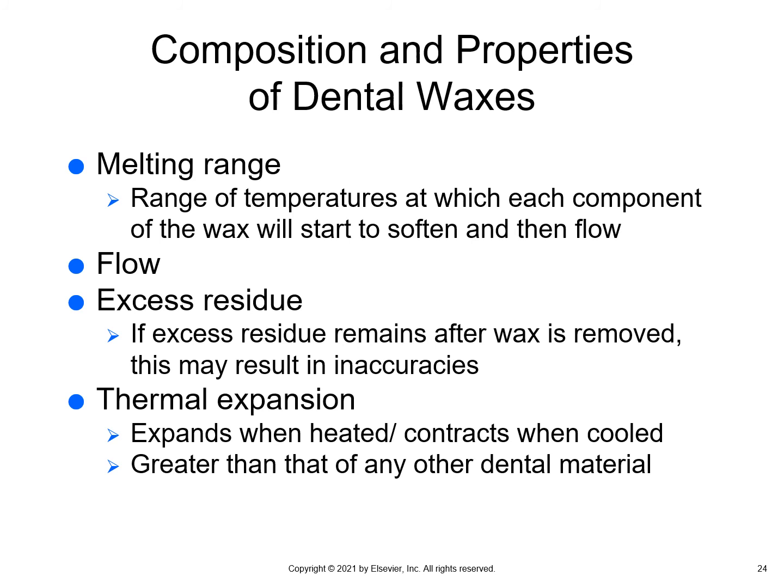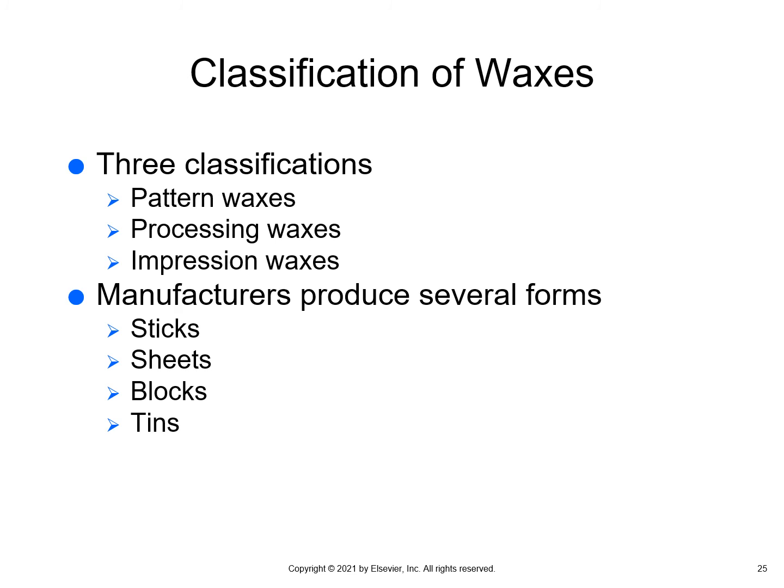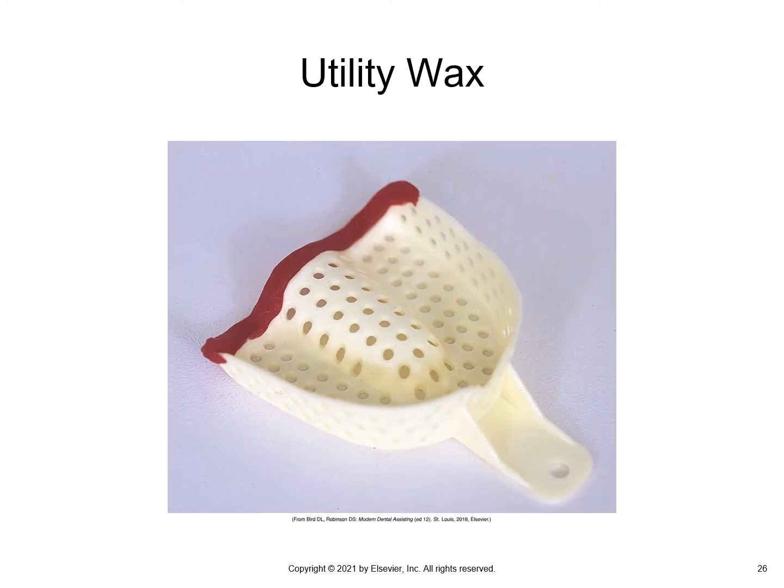So this effect is greater with wax than that of any other dental material. There are 3 different classifications of waxes: the pattern waxes, processing waxes, and impression waxes. And then they come in different forms. You can see sticks, sheets, blocks, or even tins of waxes.